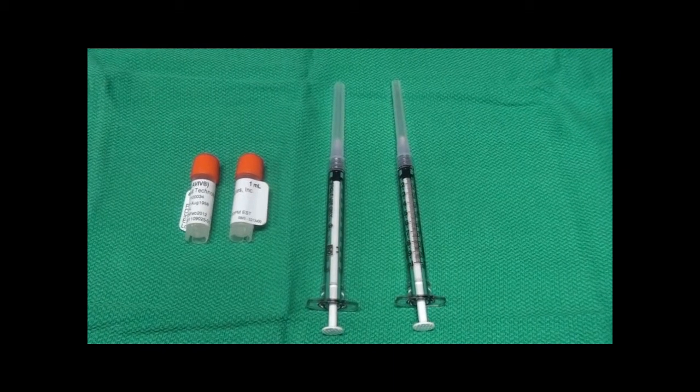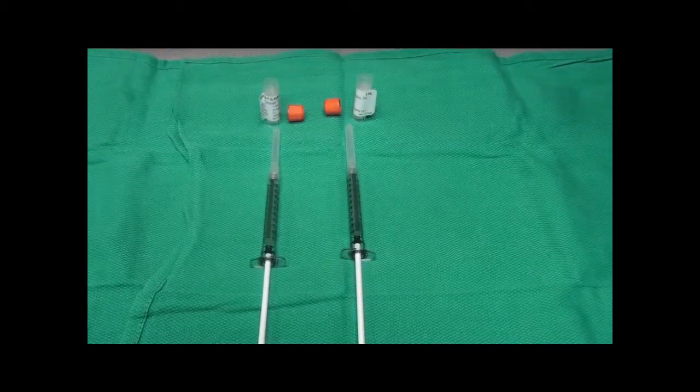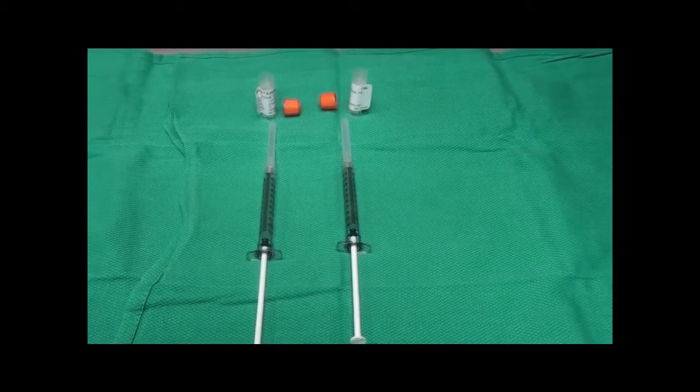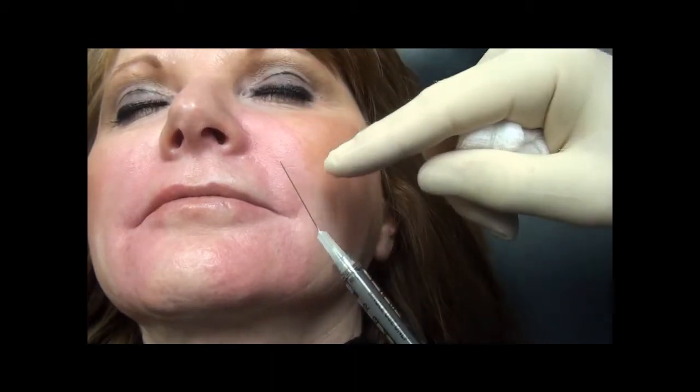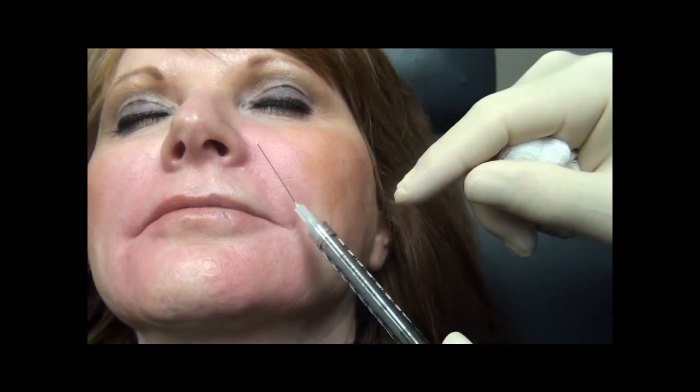We will draw the patient's cells into the 1cc syringes. The patient's cells are now ready for injection. We will be injecting her nasolabial fold wrinkles utilizing a retrograde linear injection technique utilizing a 27 gauge long needle.